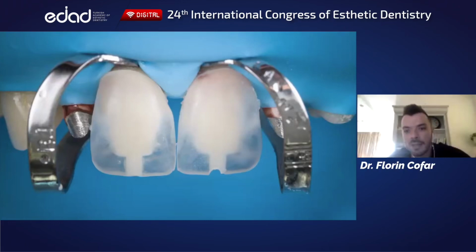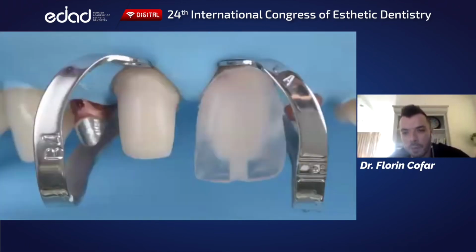And then you just take an ultrasonic tip or a burr, and you either cut it or heat it with the ultrasonic tip and remove this plastic coping. And you get a beautiful abutment that both manages the space and the color of the substrate. This is very hard to do by hand, very hard to do precisely in terms of thickness, not just putting something on top and then grinding it. I think it's a clean way to do it as a technique.